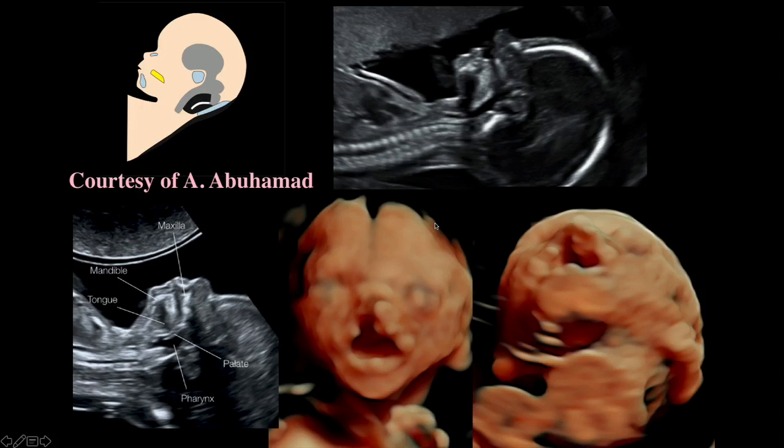Now, sometimes the clefts can be really quite dramatic, and you can see here with the mouth open how you can sort of look up in. If you're lucky enough to have some fluid inside the mouth, you can do a 3D and turn it upside down and look up into the palate and see the actual rent in the palate.